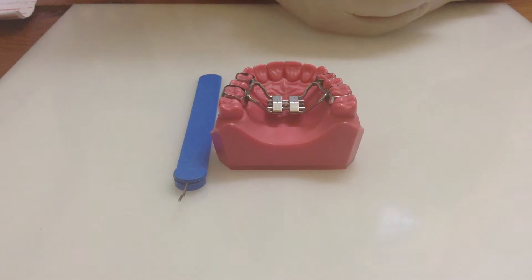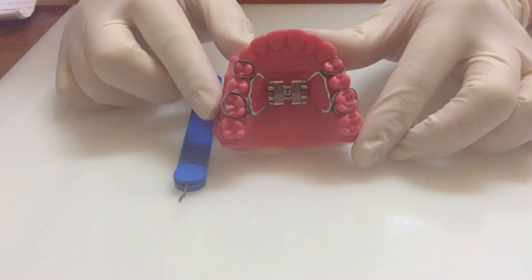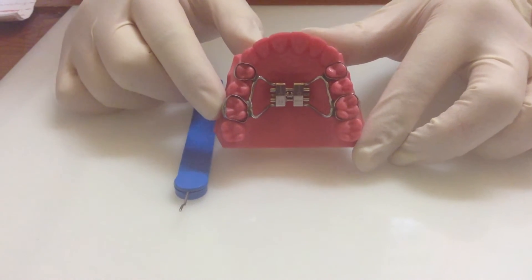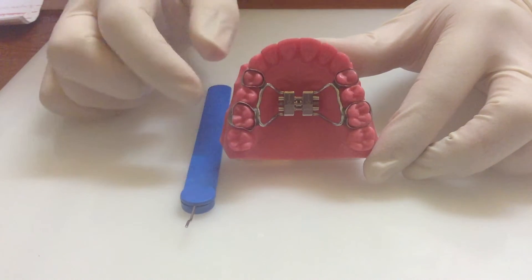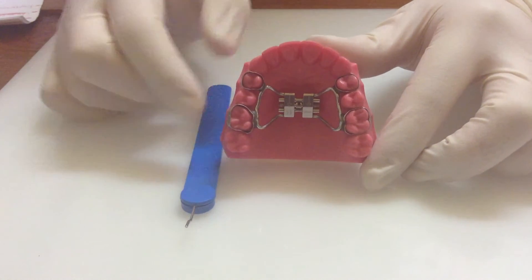I'm going to show you how to expand your RME, or Rapid Maxillary Expansion plate. You'll be instructed on how frequently to expand the plate, but it's a good idea to always expand at the same time of the day, so that you get into the habit of expanding it frequently.